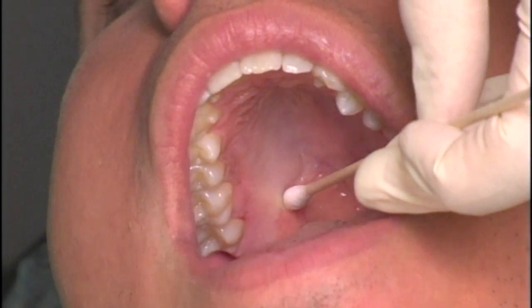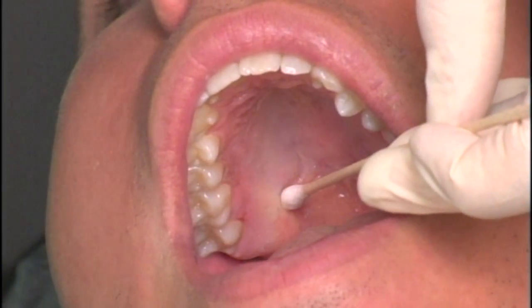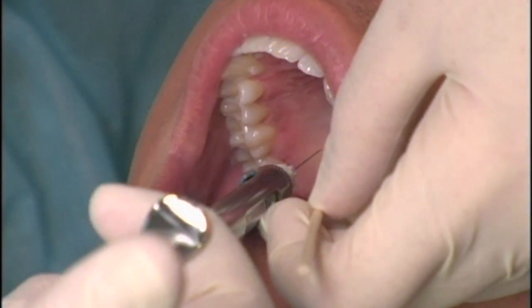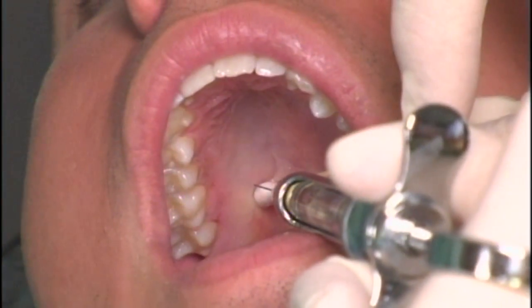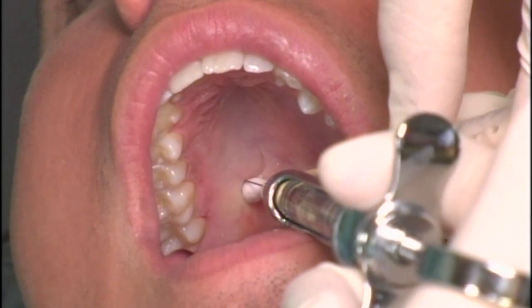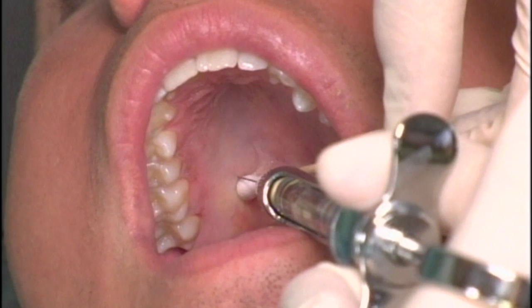A cotton swab is placed in the patient's mouth to palpate the greater palatine foramen. The needle is inserted into the soft tissues just anterior to the greater palatine foramen. As the needle is advanced through soft tissue, local anesthetic is deposited.